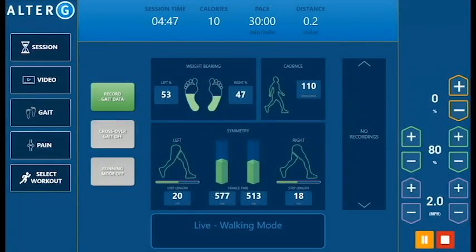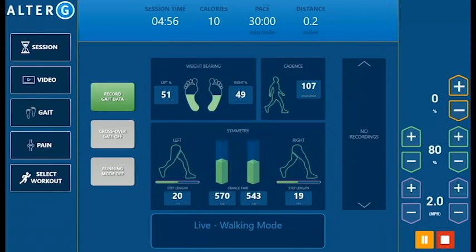The easy-to-identify gait metrics give your patients a goal to work towards. The numbers speak for themselves — you can use the data to find the exact body weight percentage to begin your patient's rehab where they can still maintain symmetrical, perfect practice biomechanics and avoid the development of compensatory strategy.